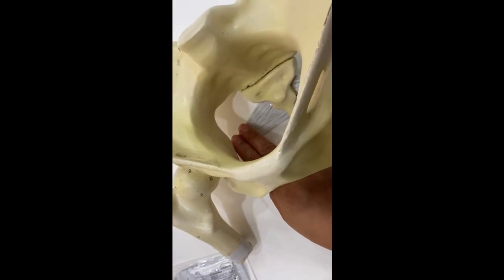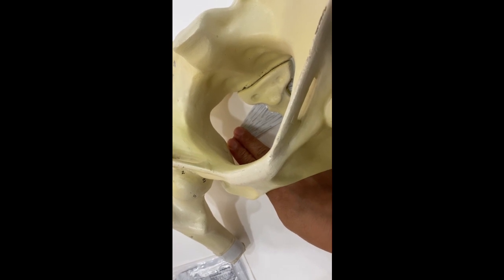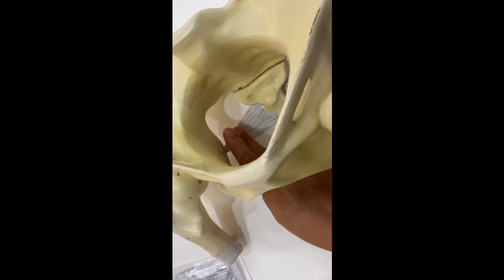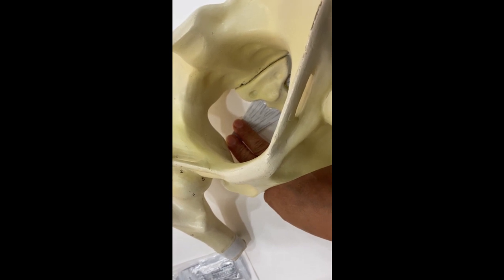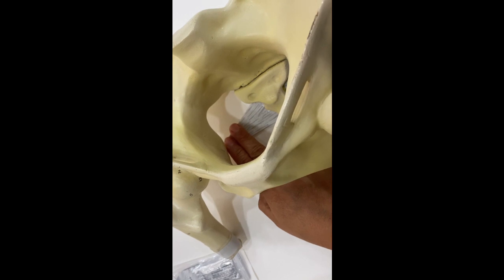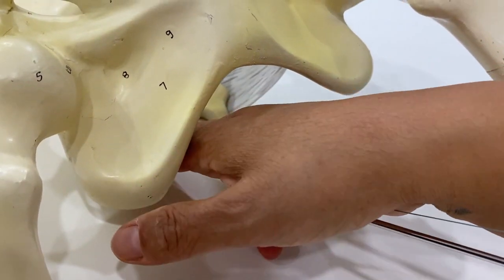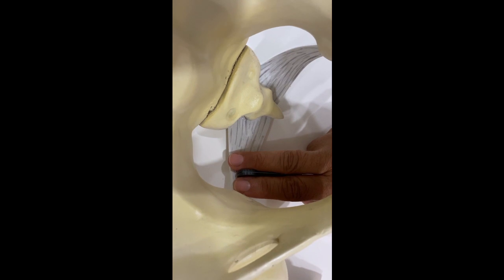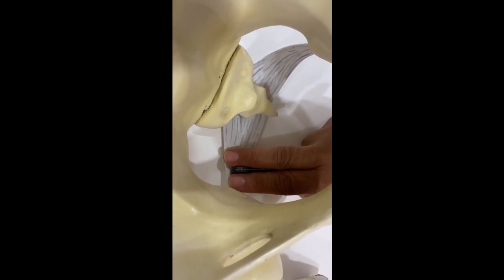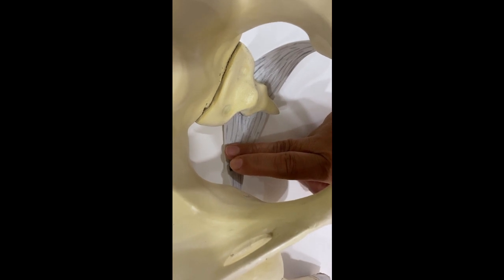Then we use the two-finger technique. Pass your index and middle finger of your dominant hand through the vaginal opening to reach the sacrospinous ligament. Your index finger should be right medial to the ischial spine to protect the pudendal neurovascular bundle, while the middle finger palpates the superior margin of the sacrospinous ligament to keep the suture half a centimeter below it, avoiding injury to the sciatic nerve. After loading the CAPU with a stitch, use your other hand to slide the CAPU along the palmar aspect of the dominant hand to reach the ligament within the slight gap between the two fingers. When you are sure the device is in the right place, push the tip of the device against the ligament with your index finger while firing to place the stitch.